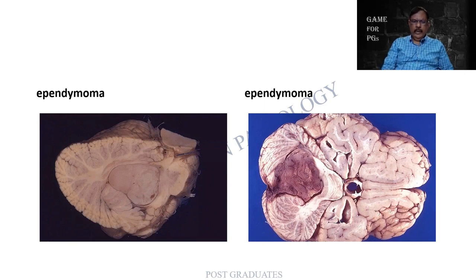As I told you earlier, you will be able to diagnose or locate a tumor according to the region. The ependymoma and the choroid plexus papilloma are lesions which project into the ventricular cavity. Look at this particular picture, well circumscribed by the cerebellum. I find a tumor with not much necrosis or hemorrhage. And this again has a little bit of hemorrhage, both of which are ependymomata.